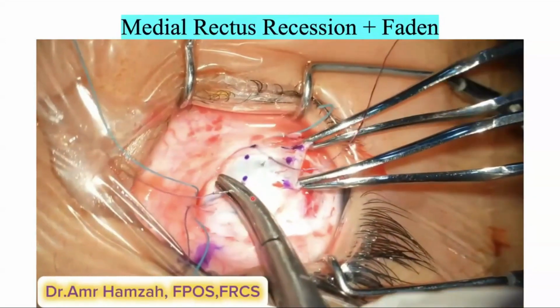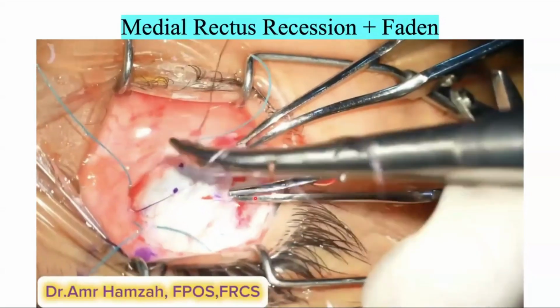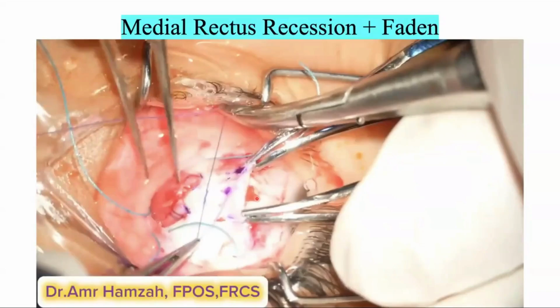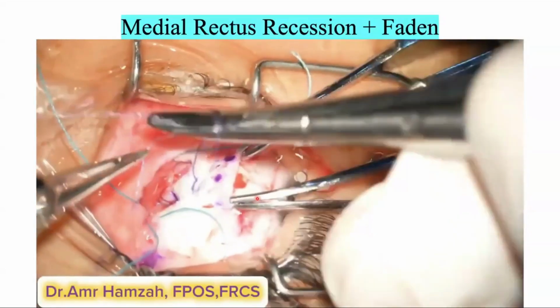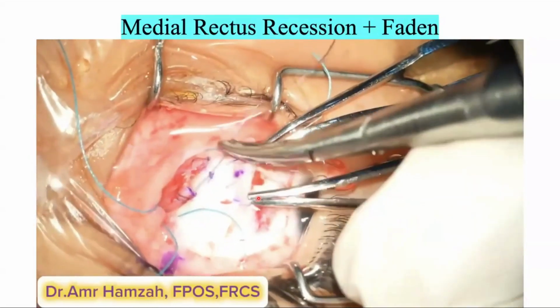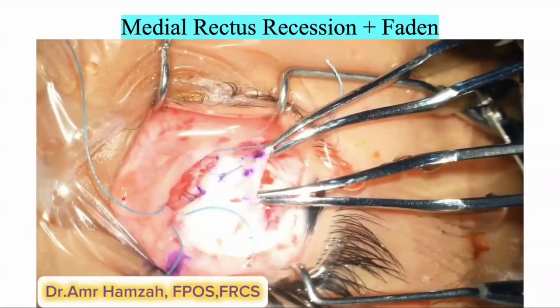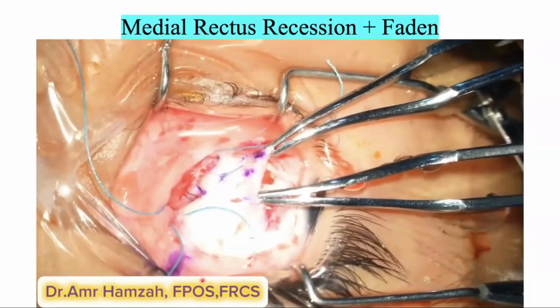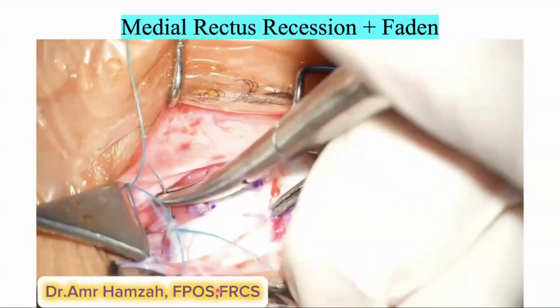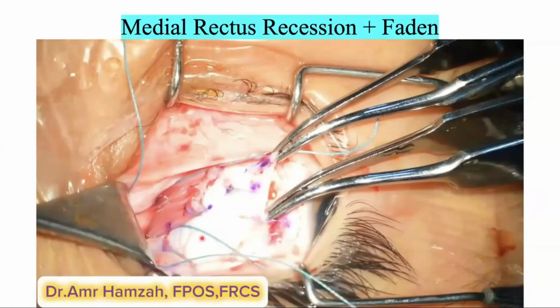Here I'm taking a scleral bite 6 millimeters from the medial rectus insertion and tying the muscle, securing it. After securing the muscle, I will take the scleral bites 14 millimeters from the medial rectus insertion and tie the non-absorbable sutures.